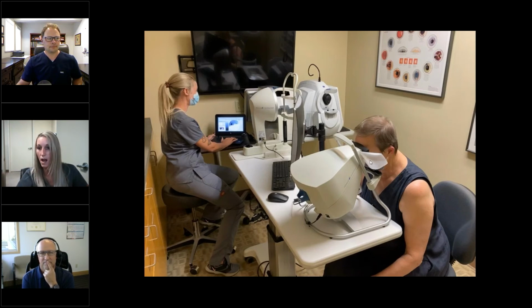So their eye is already singled out. There's no need for a patch. Those translucent eye shields come with the Smartfield. You can't see through those, so those take the place of the patch. Exactly. Okay. Good.